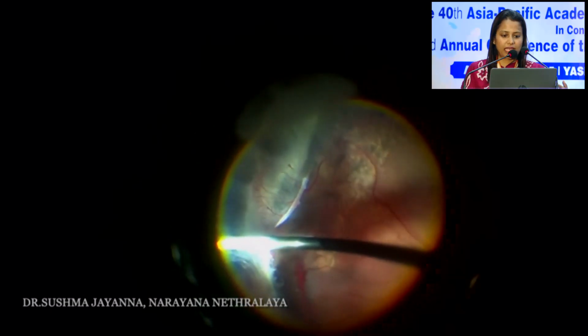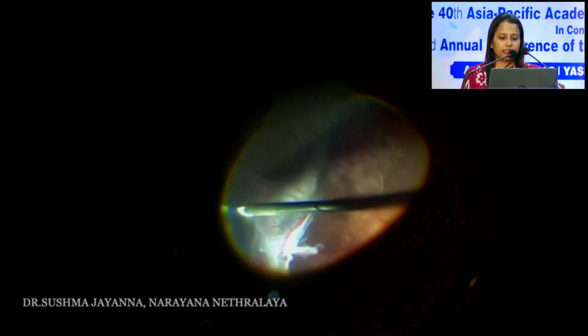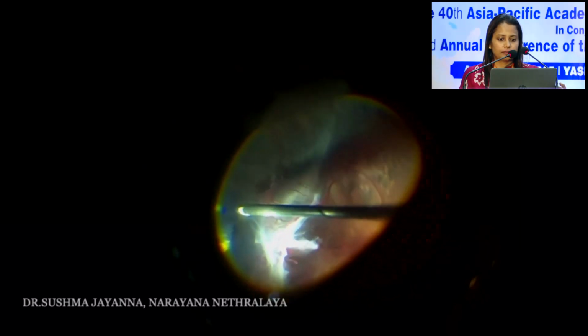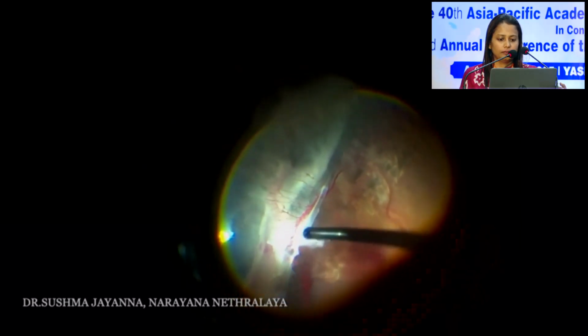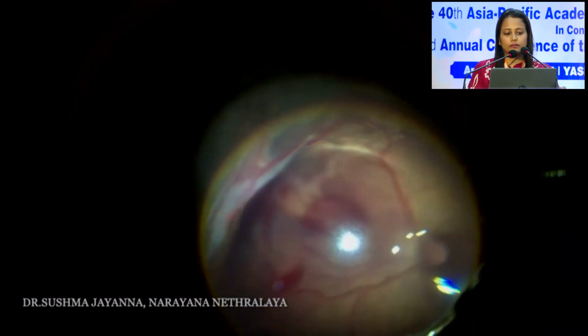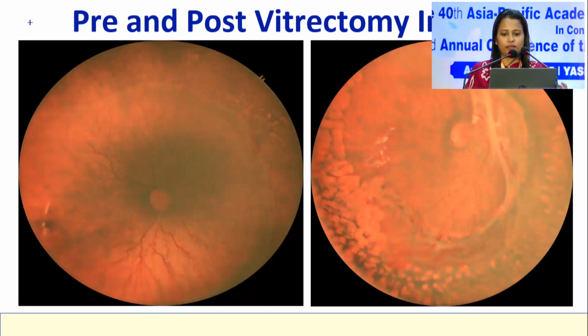You can see the detachment here, the fibrovascular proliferation. We had lasered the patient and then sent the child over. Okay, this is the pre and post vitrectomy images.